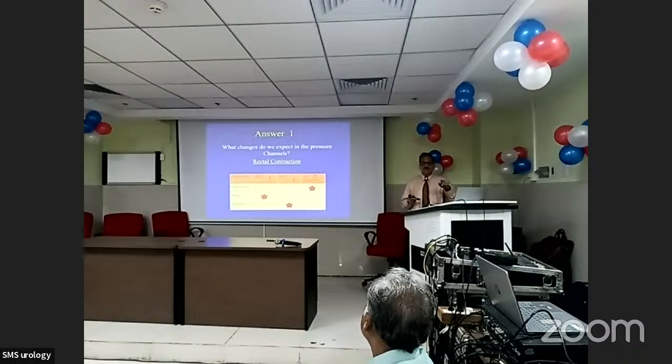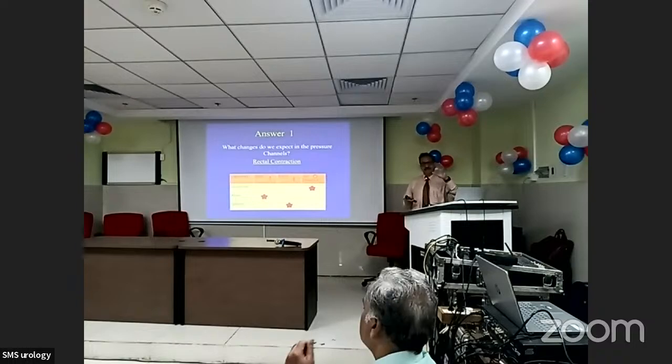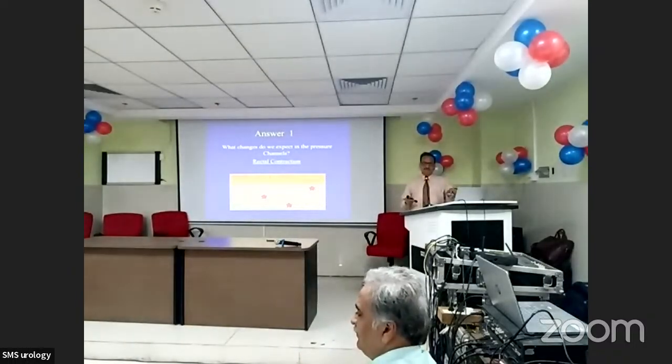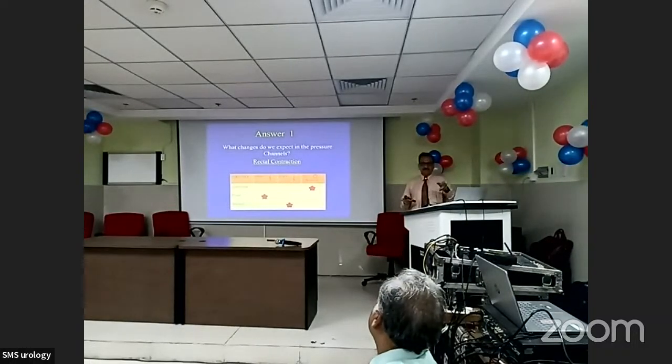So very often the detrusor pressure may show negative, which is not an artifact. It's the correct measurement, except the phenomenon has changed because the rectum is contracting. The computer subtracts the rectal rise from the intravesical pressure, which did not rise, and it may become negative. So the detrusor pressure falls.